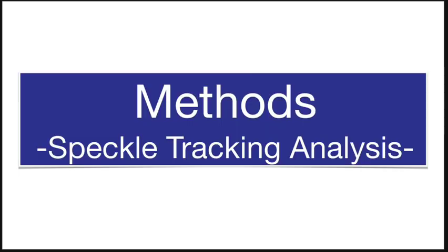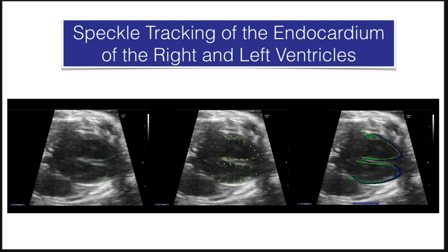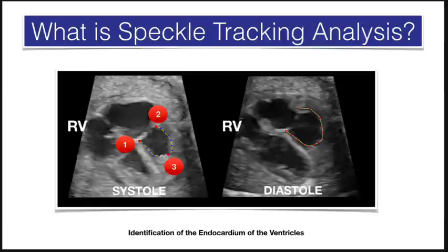Let's now review the methods used in this study. First, let's discuss speckle tracking analysis. Speckle tracking analysis evaluates movement of the endocardium during a cardiac cycle.